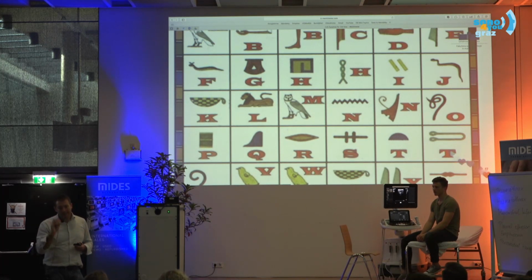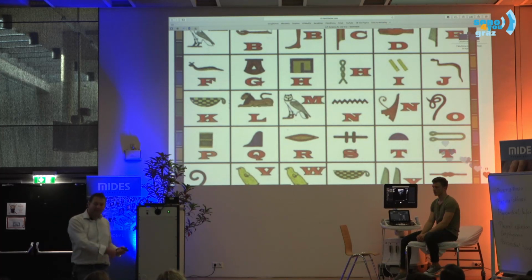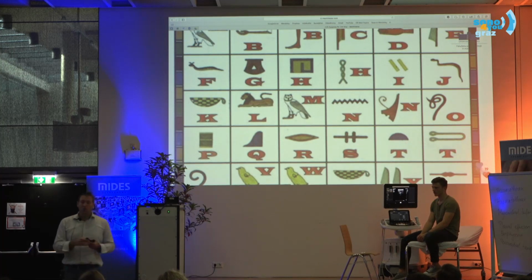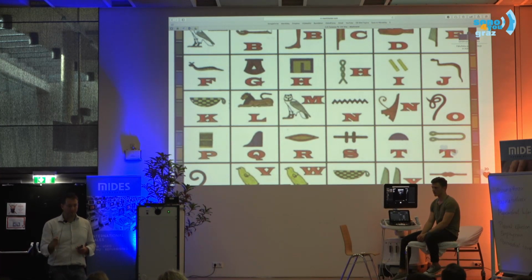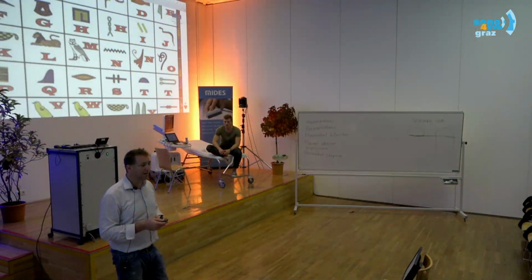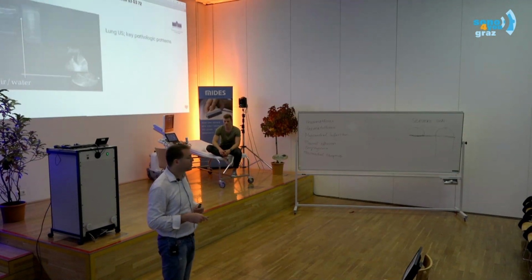And the code is that unlike with other ultrasound in the heart, where you see an actual image, that's gray and black and white, in lung ultrasound, you actually have to understand patterns of artifacts. And once this is clear, then many things, like in hieroglyphs, become totally clear and logical.